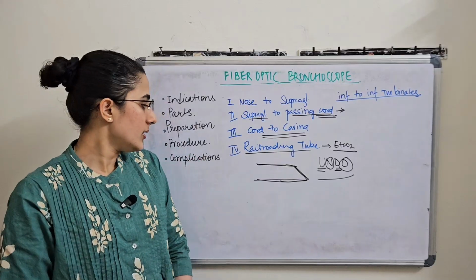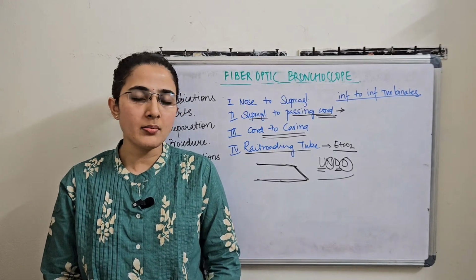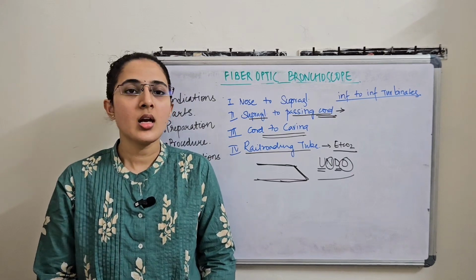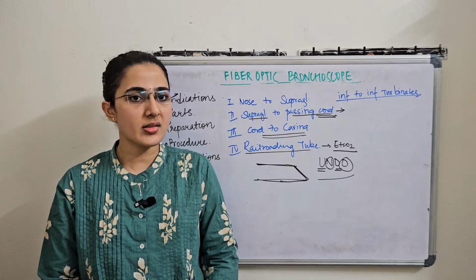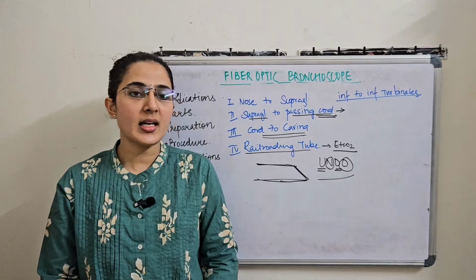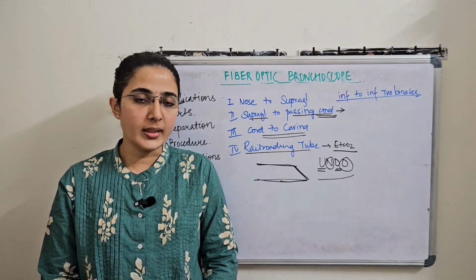Right? So what are the complications which we see? The complications usually come where there is inadequate preparation of the patient, or if the procedure is done by an inexperienced endoscopist. Difficulty to intubate happens in conditions where there is trauma or a lot of bleeding.